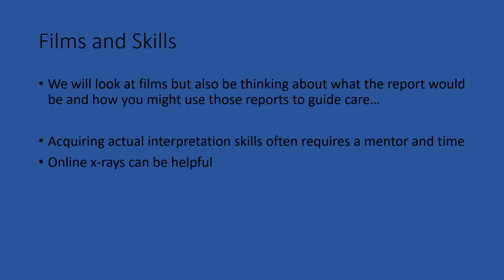So if you really are in a situation where you really do need to have true interpretation skills, then obviously you're going to be in a situation where you have a mentor, you have some time. The other thing that you can do is there are lots of x-rays online. If you just do a Google image search for a particular type of fracture, you can easily see what that fracture is and get an idea of what the issues are for the treatment of that patient.